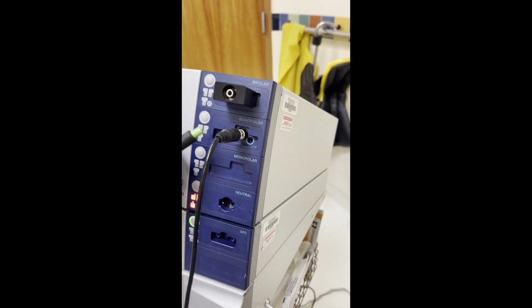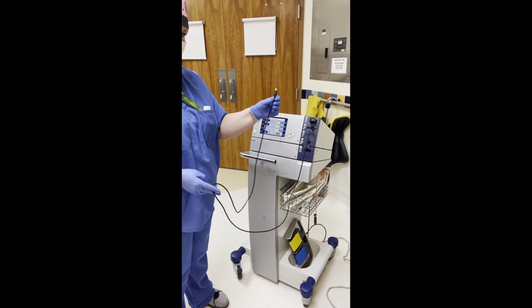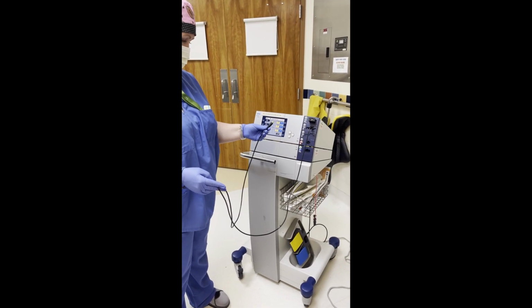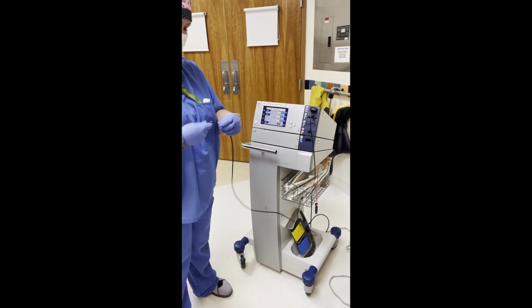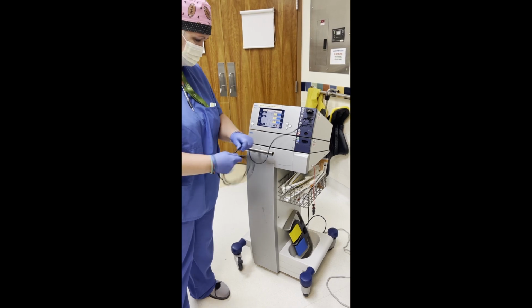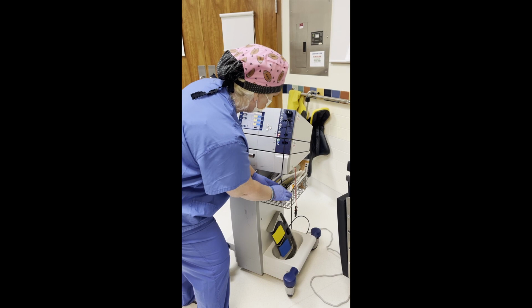That says monopolar. You're not going to use this, because anything that you're going to use in the emergency cautery is not with that, but just leave this plugged in. Don't lose it. Please, please, please. I'm just going to tuck this down here in our nice little handy dandy basket.